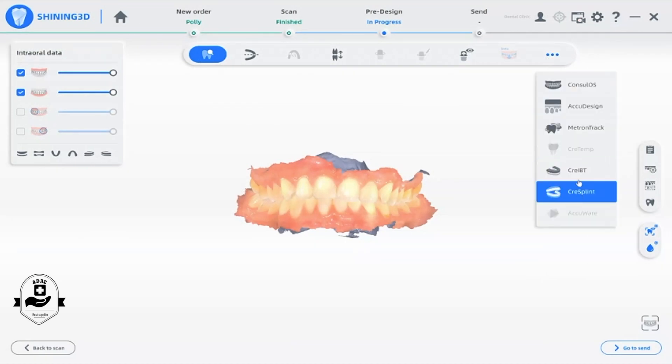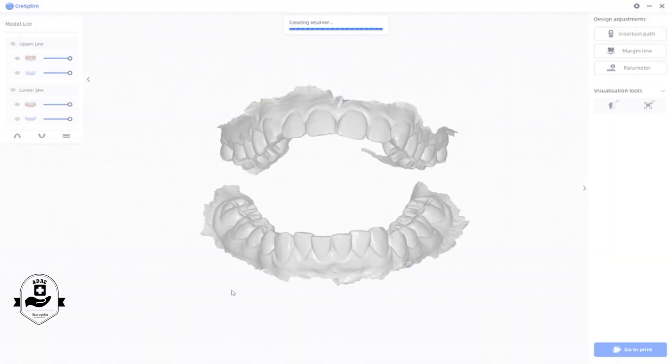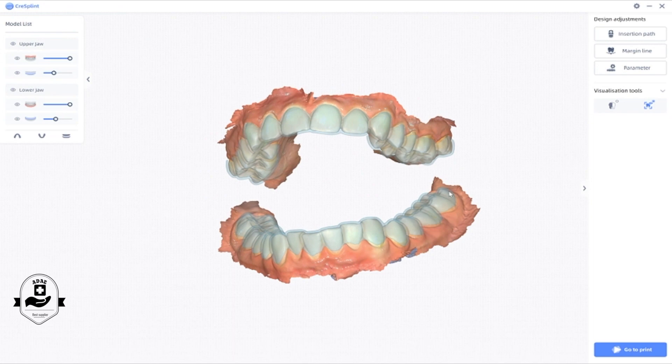We want to bring users a more efficient solution for clinical applications, so we developed the splint. It is compatible with night guard and retainer designs. The software allows us to generate the splint with one click, and the user can also modify the splint by adjusting the margin line and undercut.